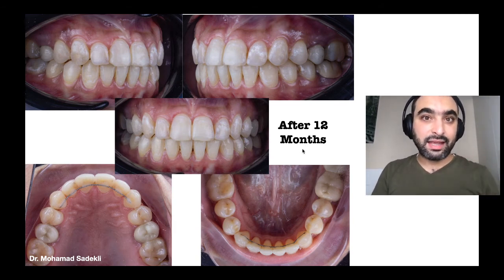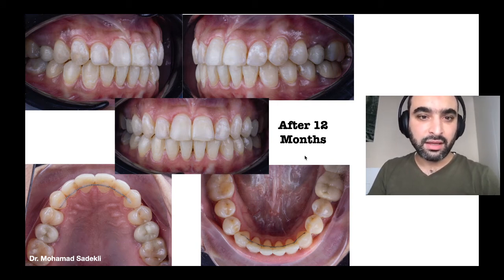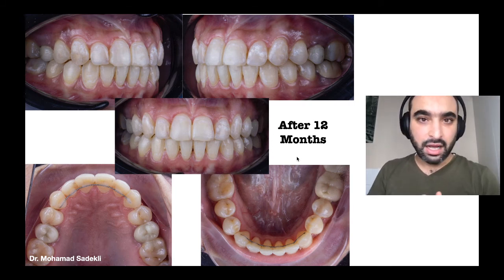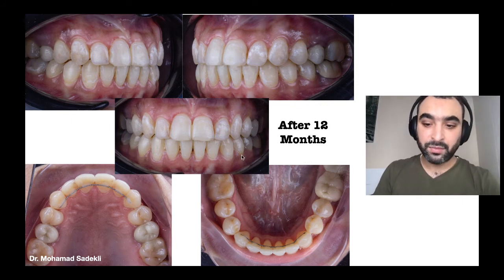So the case takes exactly 1 year to finish with a really cooperative patient. She was using the elastic very well, exactly as I told her, 8 hours or 16 hours or 12 hours. When I reached stainless steel wires, she was using the elastic for 12 hours.